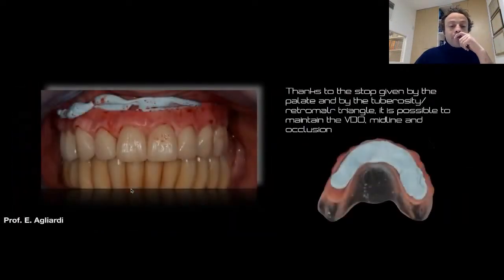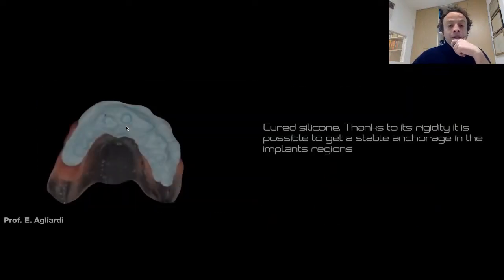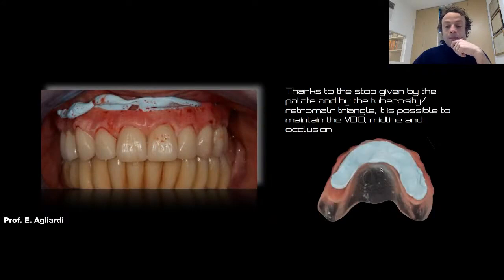In that way we ask the patient to close, and on this silicone we can see the position and also the angulation of the implants. And it's easy to place these prostheses in the mouth because of the palatal stop here, which helps the prosthesis to have a precise position intraorally.